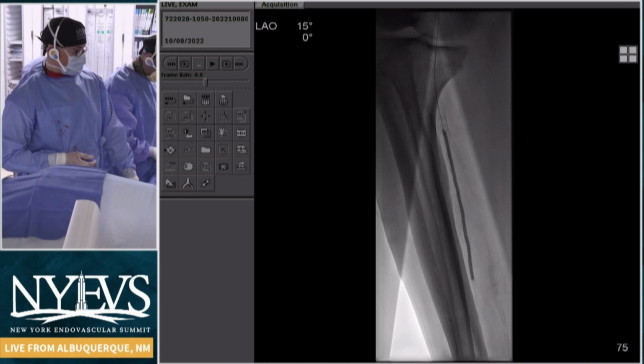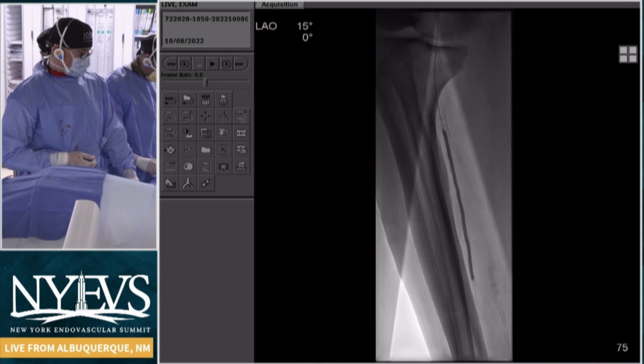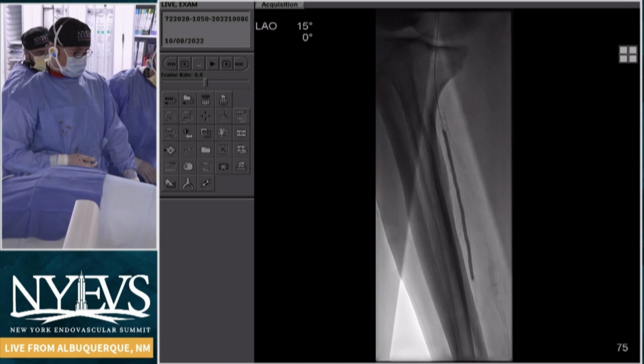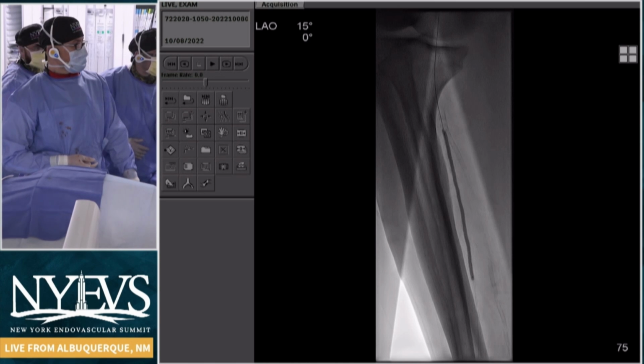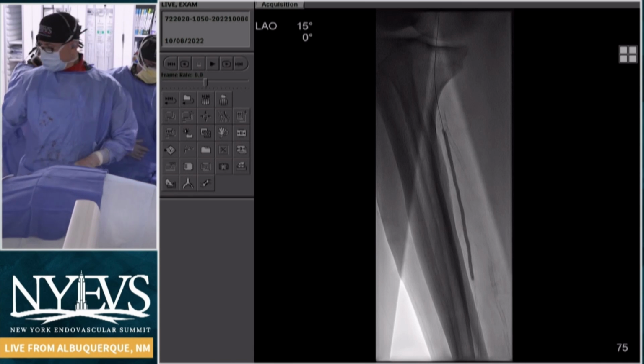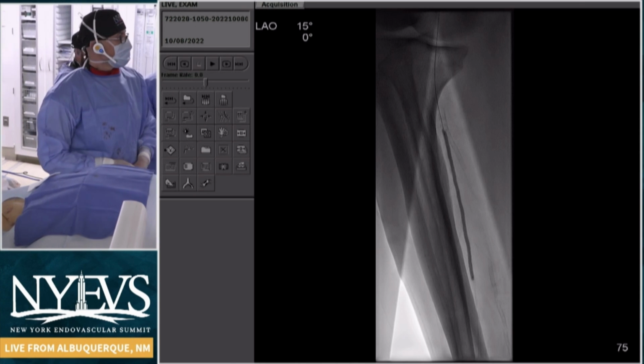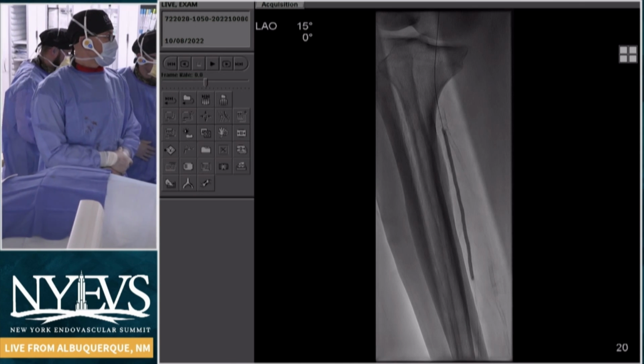Yeah, and the ALPS registry bore that out. At about 8 weeks or so, the TcPO2 rises to a significant level if you have a successful DVA. And obviously now people are also looking at flow rates with ultrasound, like you look at in a dialysis fistula. What's the flow rate as soon as I'm done? They look at proximal third, middle third, distal third of the outflow vein, which is the conduit in this case, to really see, is it progressing the way I want, or is it starting to deteriorate, requiring reintervention? So we have a lot to learn in terms of CLI endpoints for sure.